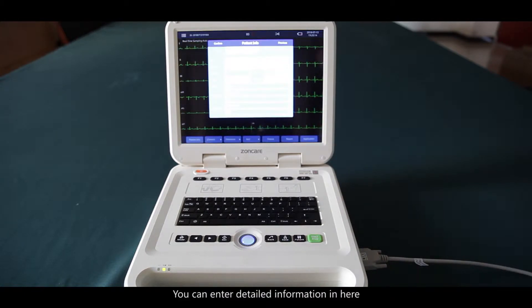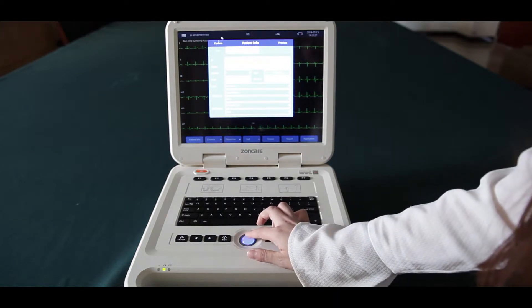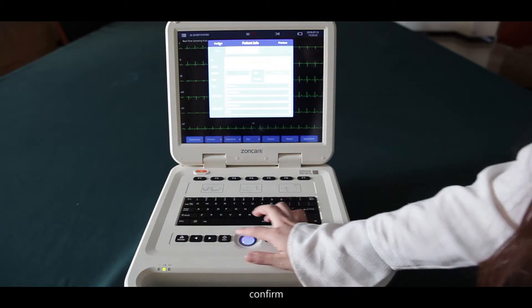You can enter detailed information here: name, gender, department, age, bed number, race, and medicine. Then confirm.